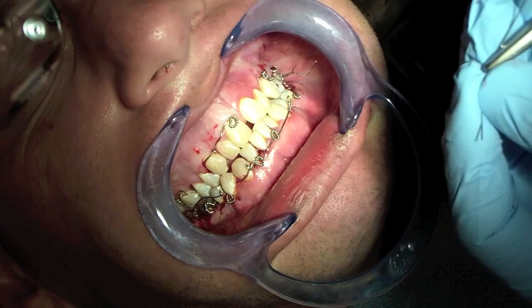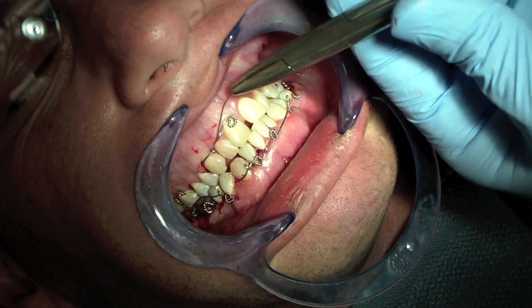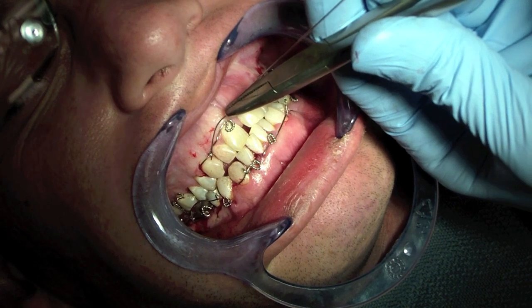Hey folks, Ashley here at allthingsidentistry.com and what we're going to be doing here is fixating the mandible to the maxilla.